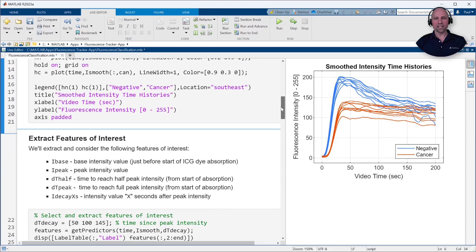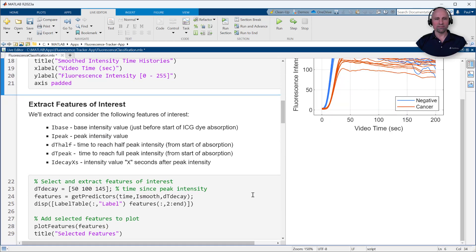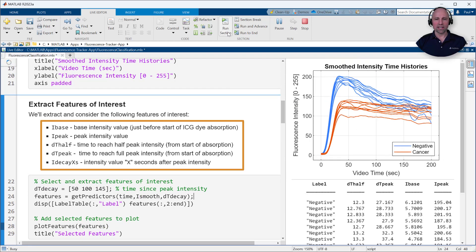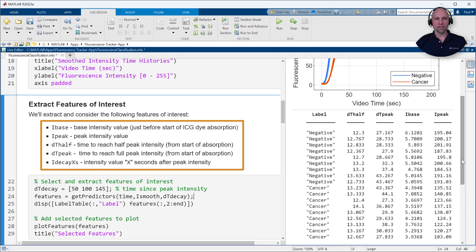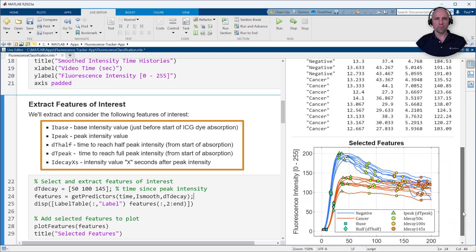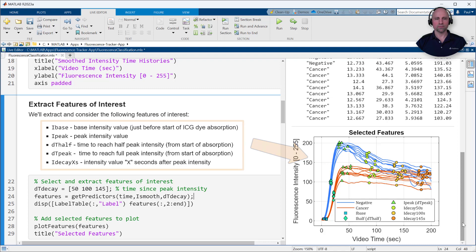For example, for each labeled region, we'll extract the following features: the base intensity value before dye absorption, the peak intensity value, the time to half and full peak, and the intensity values at 50, 100, and 145 seconds after the peak occurs.